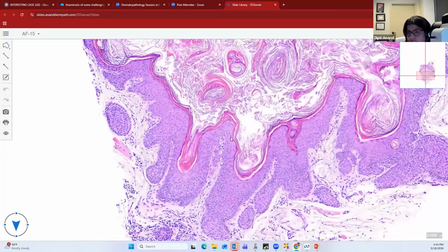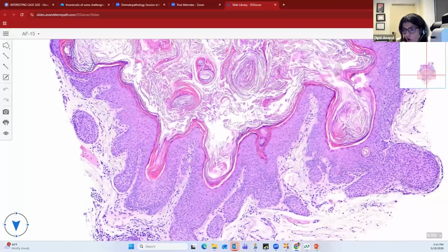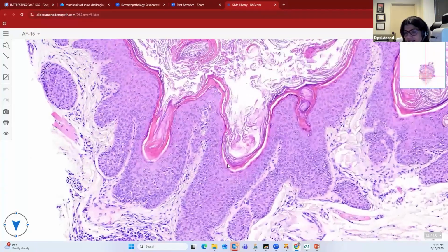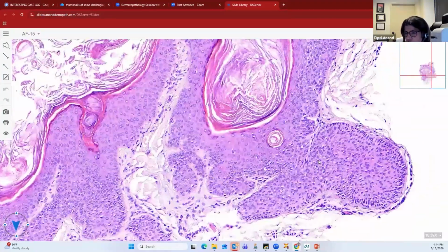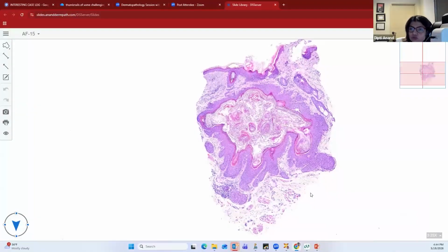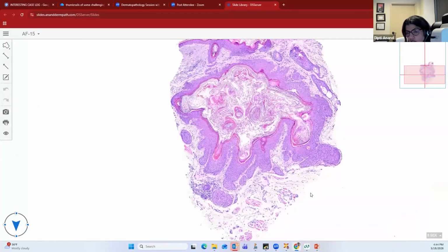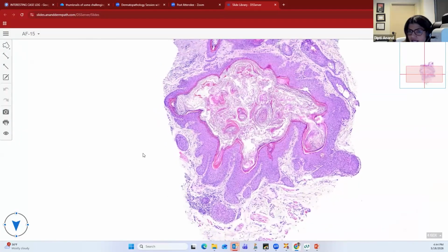Now, the lining epithelium of a pilar sheath acanthoma is going to be derived from your tricholemmal cells. So remember, we talked about tricholemmal epithelium being present in a tricholemmal cyst. So similarly, the wall of the proliferating cyst is going to be lined by this thick epithelium, which has these pink eosinophilic pale cells, and that's your tricholemmal epithelium. So a dilated pore with a much more thick wall and pink acanthotic buds arising from the cyst wall. So that is going to be your pilar sheath acanthoma.